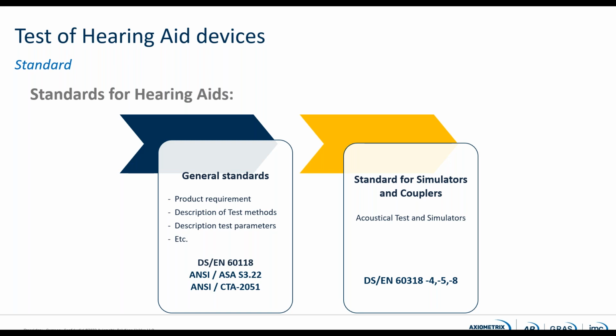And these standards are actually pointing at the standards for simulators and couplers, the IEC 60318, and in this case, that's 4, 5, and 8.